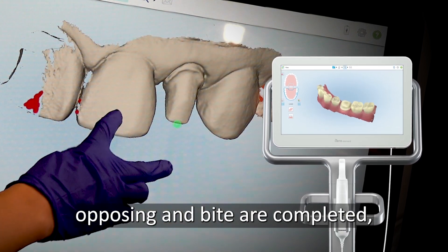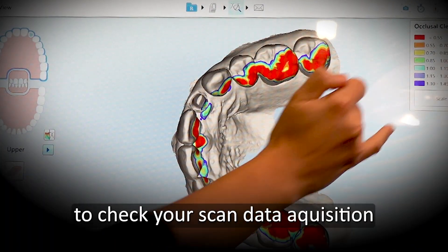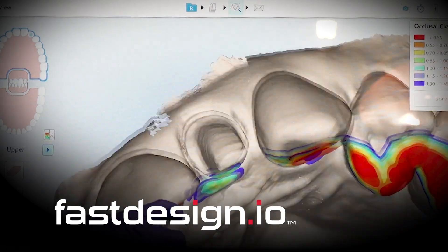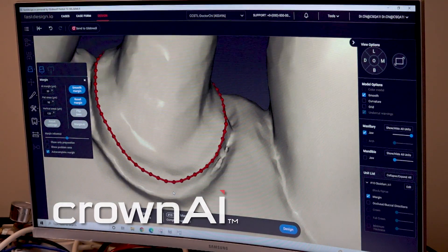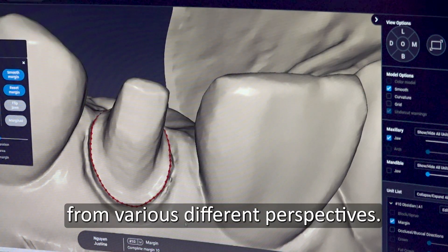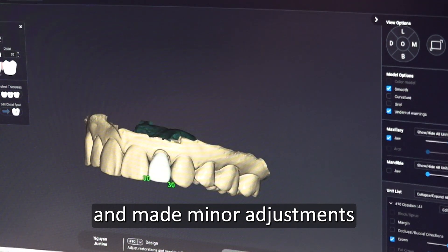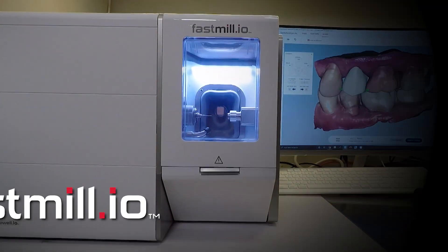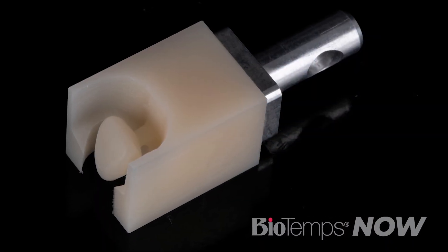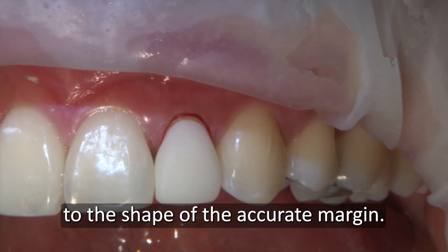Once the scan of the prep, opposing, and bite are completed, I recheck the prep and occlusal clearance by checking the iTero occlusal gram. It's important to check your scan data acquisition before the information is sent over to the Glidewell I.O. and Office Fast Design Software and Design Station. Artificial intelligence identifies the margin instantly as shown by the dotted red line. I checked it and marked my final margins, making sure to view from various different perspectives. I received a BioTempsNow crown proposal with just a few clicks and made minor adjustments to dial in my contact parameters. Finally, I used my Fast Mill I.O. in-office mill to fabricate the BioTempsNow temporary crown chairside in just a few minutes. Properly fitted BioTempsNow provisionals allow the soft tissue to heal to the shape of the accurate margin.